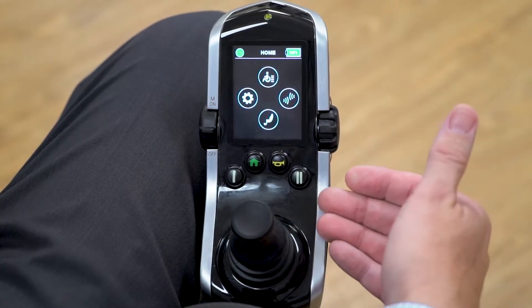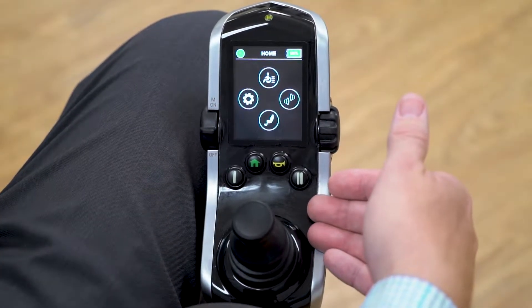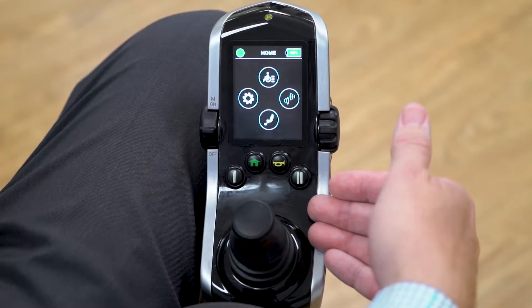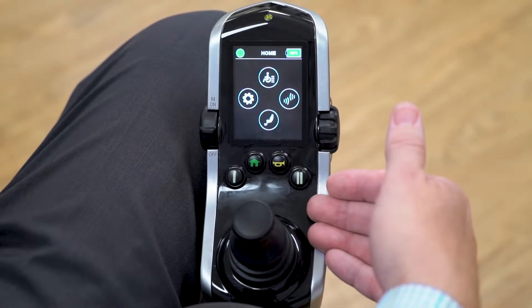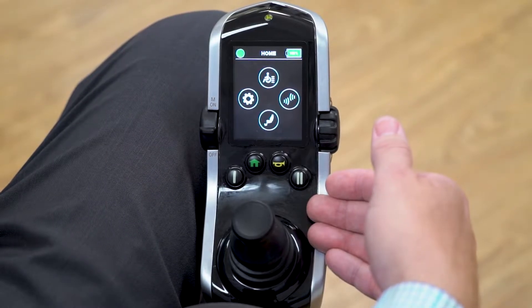In this video, we're going to be reviewing the steps to pair your Q-Logic 3 expandable electronics Bluetooth to an iPhone or an iPad. The steps are exactly the same for the iPhone and the iPad.